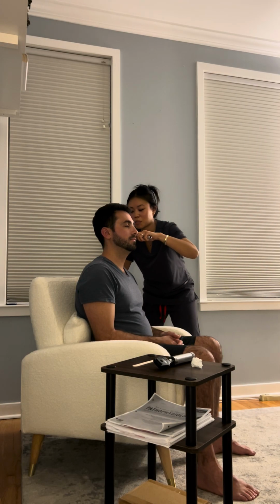Same on this side, pull the pinna out, back. Okay, very good.